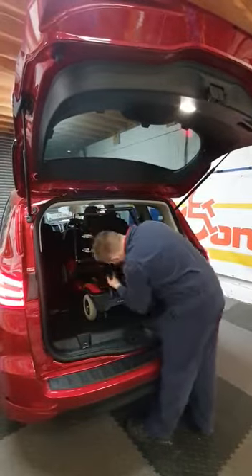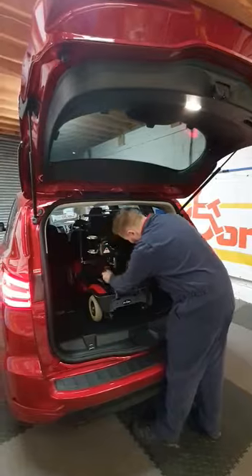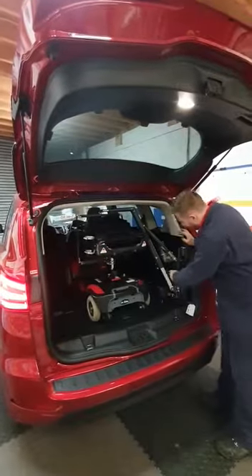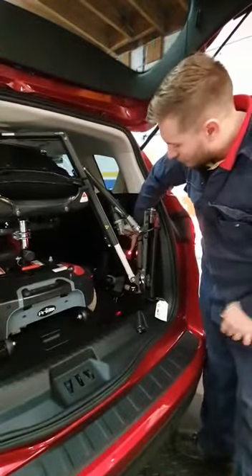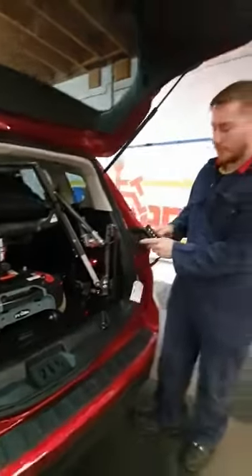The first thing we do is disconnect the seatbelt, which we just loop around the seat post here. Then just through here we have our on/off button. As you can see it switches on and off — you get the red LED on there and you get a flashing one on the handset.